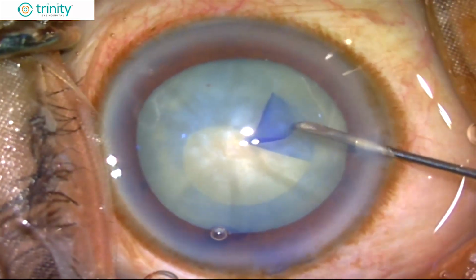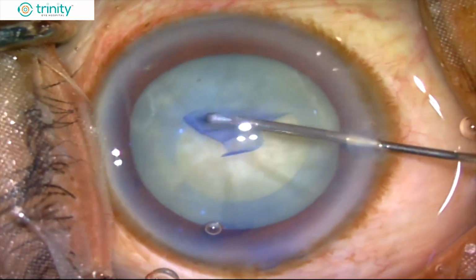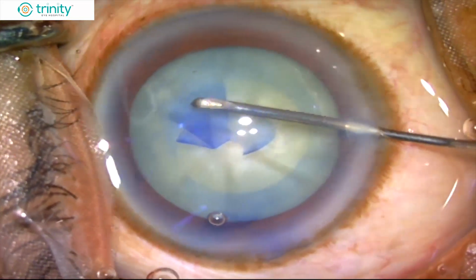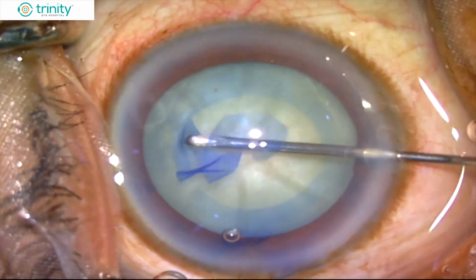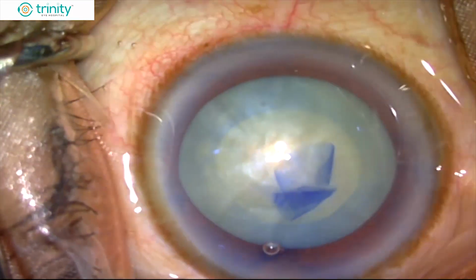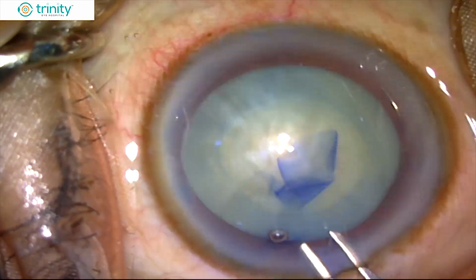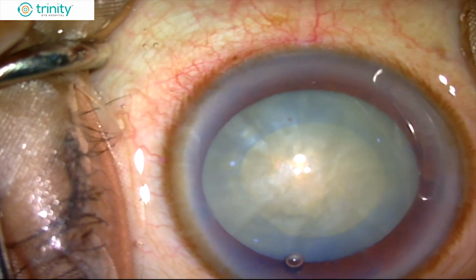You have to change the direction of the force that is applied for the rhexis depending on the rhexis margin, how it is proceeding. If you feel it is extending, it is always better to change the direction of the rhexis force. Now you can see the rhexis is completed. I am removing the rhexis capsule tag.